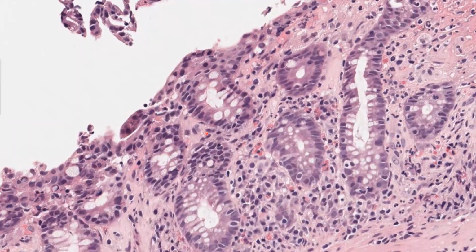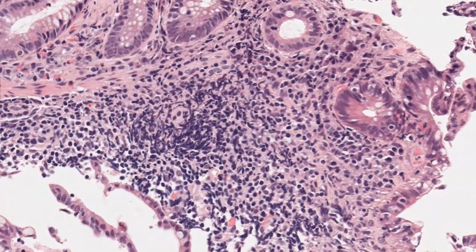Any increase in the intraepithelial lymphocytes at all? Right, so some of you said yes, some of you said no. Okay, we will come back to this, but before I come back to this, I just wanted you to tell me what is the number of inflammatory cells, intraepithelial lymphocytes, that if you go above it, then there is an increase of intraepithelial lymphocytes. Do you have any number in your mind?